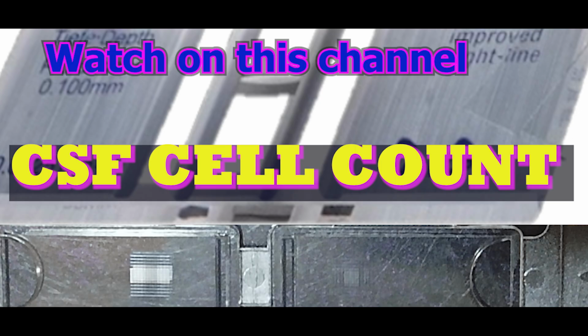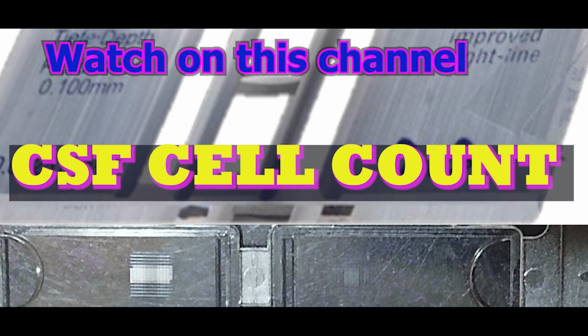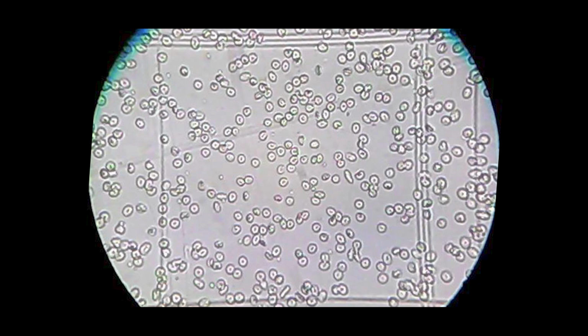Since the RBC count is very high, the area counting is less. These small divisions for each 1 square millimeter help to count the cells accurately, avoiding the repeat count of each cell. Also, it gives the idea of proper dilution, mixing and proper charging of the sample onto the chamber. When we calculate for 1 square millimeter of area, that is the area counted.